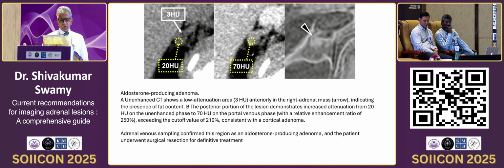When you give contrast in the portovenous phase, the enhancement is quite significant, from 20 it just rose to 70. So the relative enhancement ratio is about 250%, which is definitely diagnostic of a cortical adenoma, and you can use this in your clinical practice.